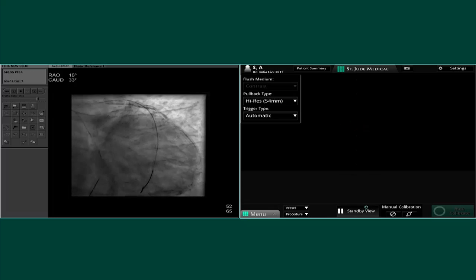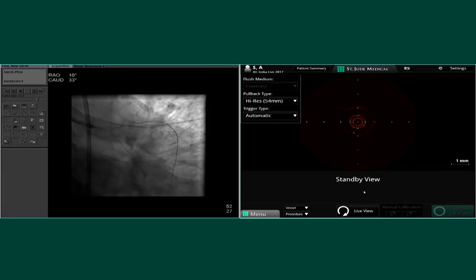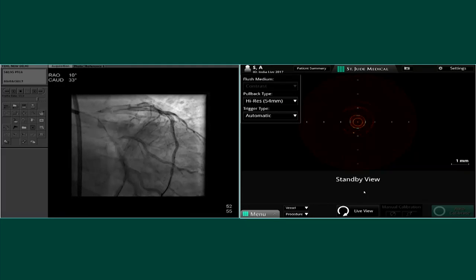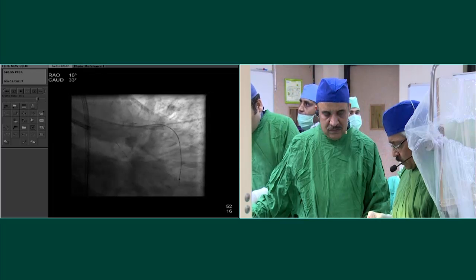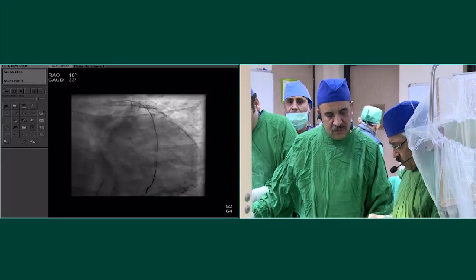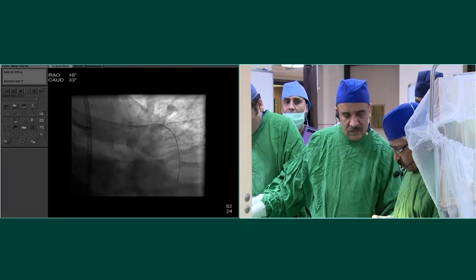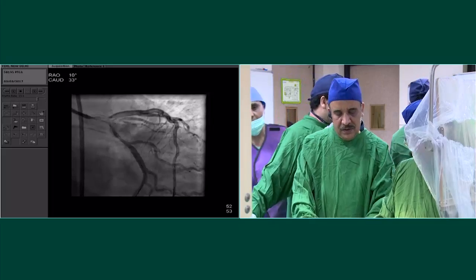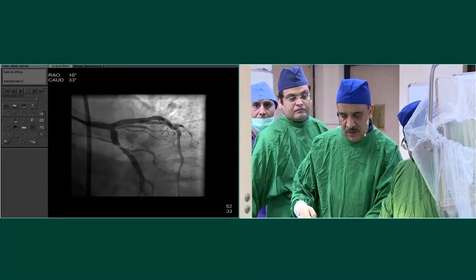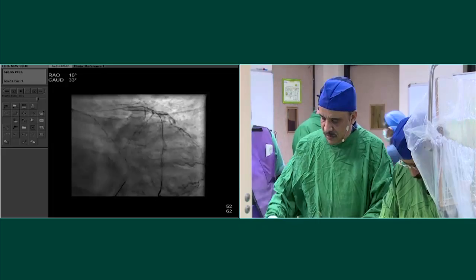Okay, that slight indentation that you see in this view. But you want to see the OCT, you don't want to leave now? It was a wonderful demonstration. Maybe in the minute that we have, you can see the OCT. Okay, if I can get this catheter in the meantime. These are very irritating because they don't come out of the hole so easily. They should put a marker there somewhere. Okay, so just give me exactly 1 minute, because I do want to see myself whether I managed to oppose, and then also take your opinions on this.